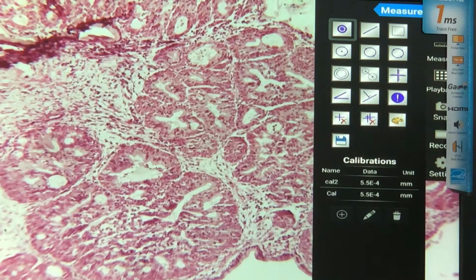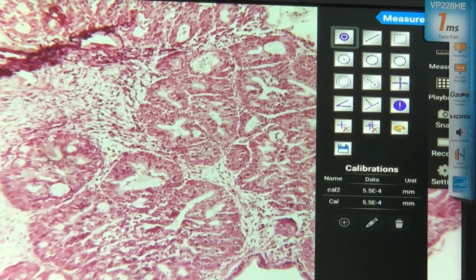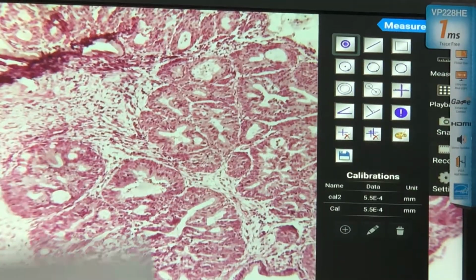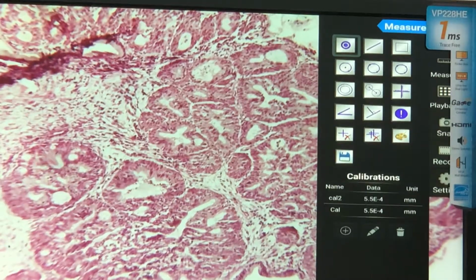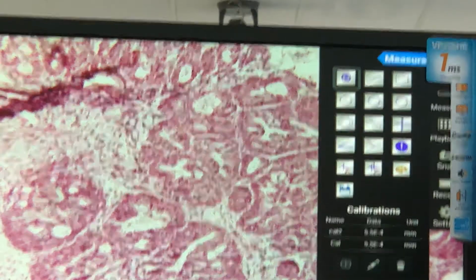So this one, we go to chronic endocervicitis with squamous metaplasia. I checked the manual. This is page number 18, slide 77.